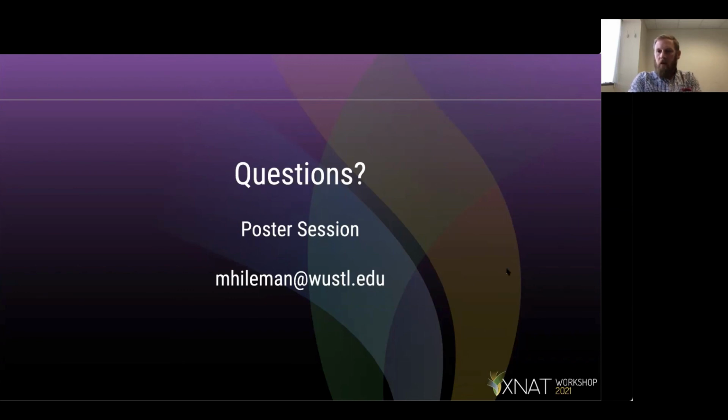Ivan asked if I can talk about how we archive the data. Using CTP, we're doing the DICOM send step at the end, which sends it to our DICOM SCP receiver. At least in my experience, it's a pretty standard way to get DICOM imaging into an XNAT. If you meant something more specific than that, just let me know.